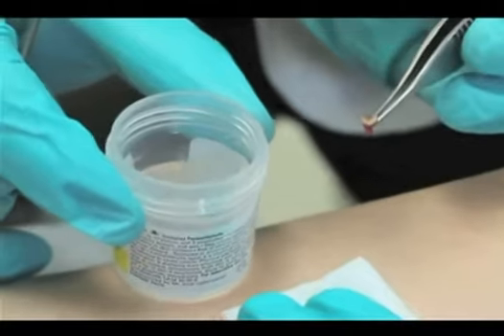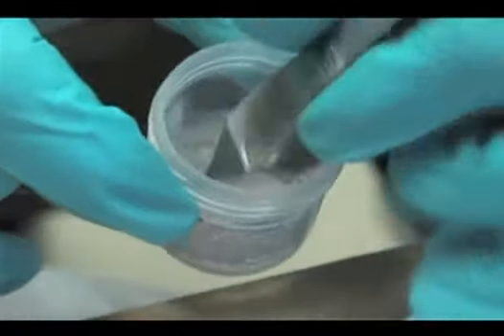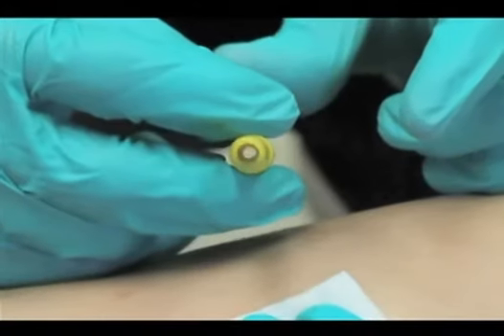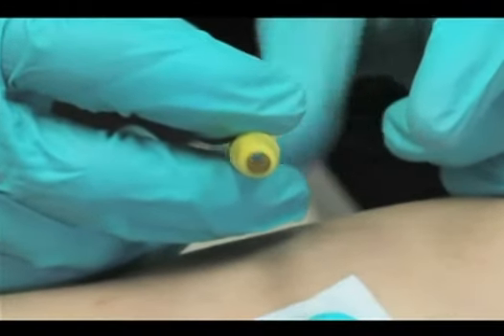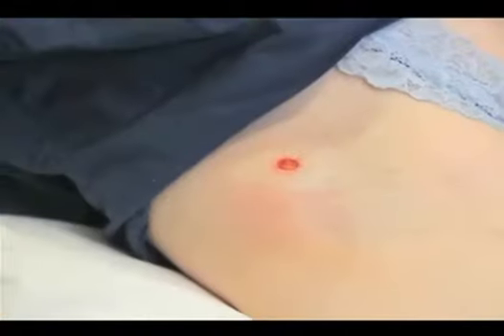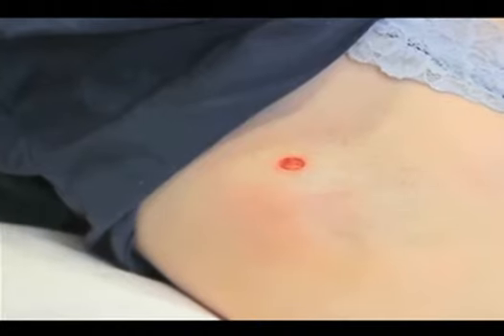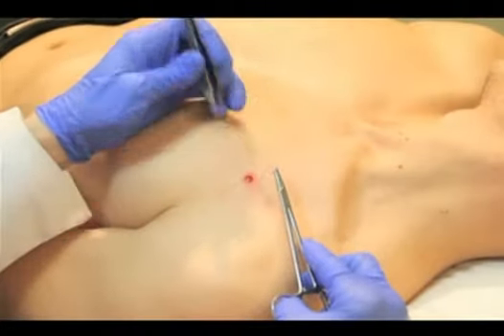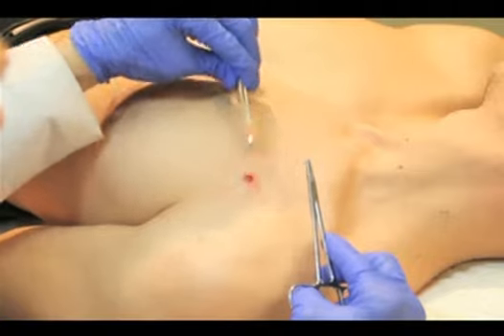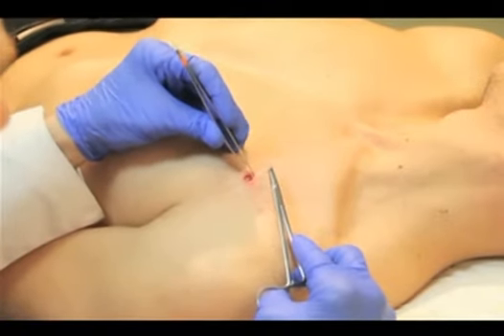Place the specimen in a labeled bottle that contains the appropriate reagent, here, formalin. Check the punch instrument to be sure no tissue remains there. A good rule of thumb is to be able to see through the entire hollow tube. When you have finished the biopsy and have obtained the specimen, you may suture the wound. Place the sutures perpendicular to the long axis of the punch defect and/or perpendicular to the skin tension lines.